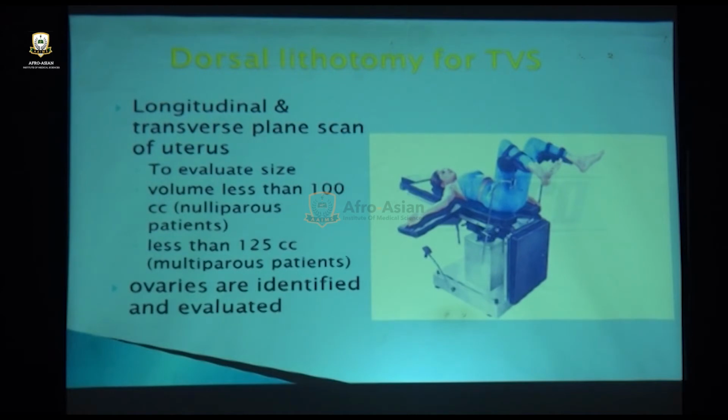So you don't need to go for this sophisticated table. You can do it otherwise as well. What some people do is they bring the patient to the edge of the bed, and then put the two legs on the arms of a chair which is at the foot end, and that also gives an access.